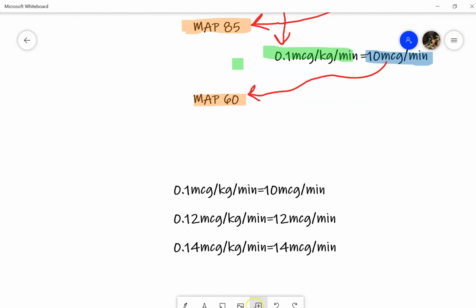So when we're titrating up on our epinephrine drip, let's say that for purposes of our little scenario here, and again, these numbers are probably too simplistic on how easy it is to titrate these drips, but let's just say that, for our sake, a dose of 14 mics per minute was going to equal that MAP pressure of 65 that we wanted.